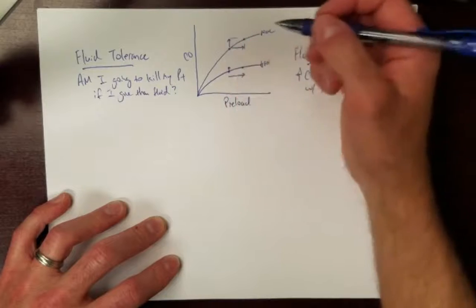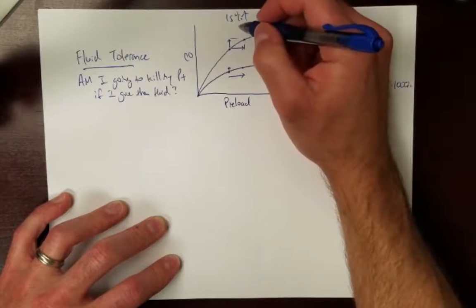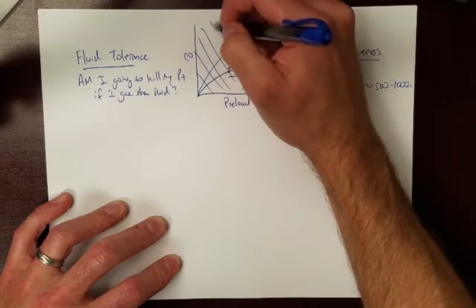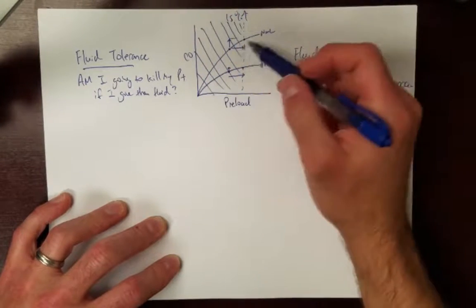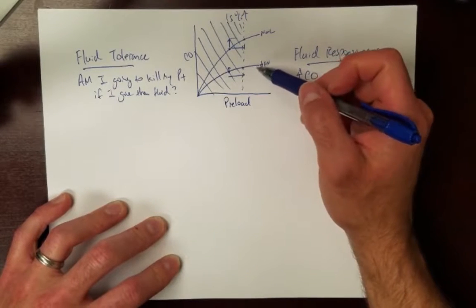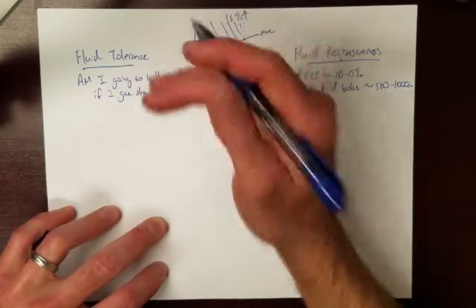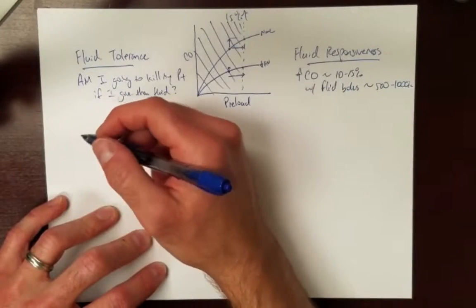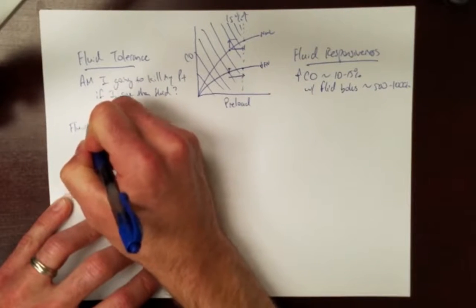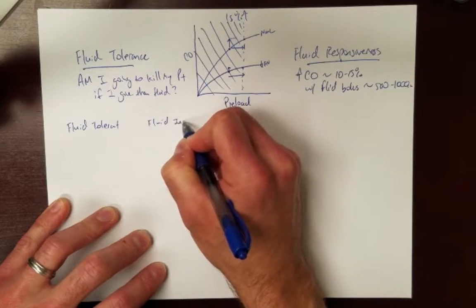So instead of looking at these specific numbers and trying to say, okay, are we getting a 15% increase in cardiac output, we're really just saying, is my patient on this side of the curve or not? Am I away from that portion of the curve that's now flat, where I'm not getting any improvement and I'm only hurting my patient? So we're really just asking a very general question. Could this patient receive fluid and not get hurt? So how do we do that? Well, to talk about fluid tolerance, let's first start with saying our patient could be either fluid tolerant or fluid intolerant.